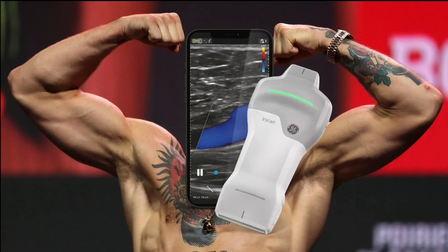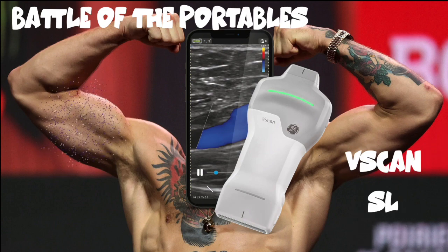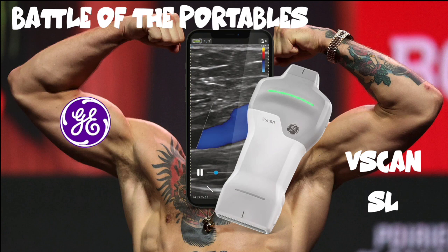Here we are with a very long awaited and anticipated review courtesy of Critical Care Northampton of the new GE vScan SL portable ultrasound probe. Did it meet up to the challenge? Is it worth buying? And what did we think? Here we go.